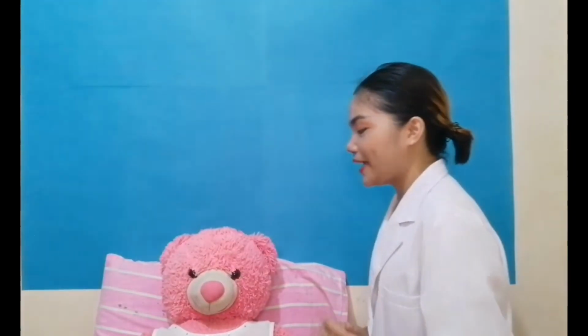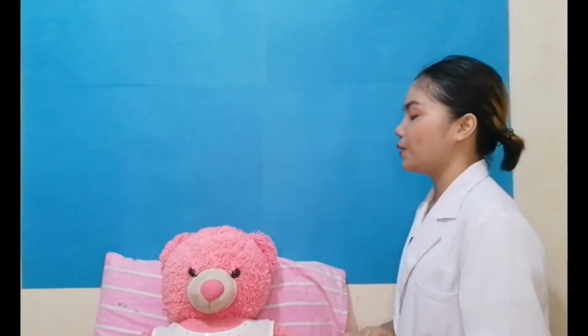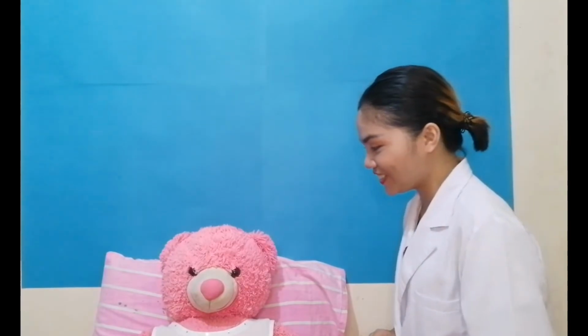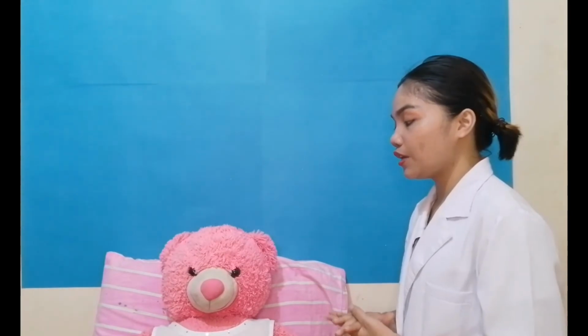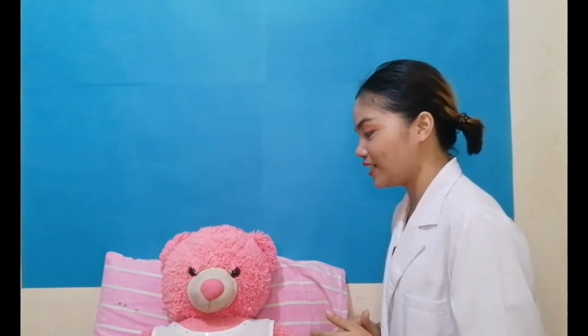Hi sir, good morning. My name is Kabilin, a student nurse from the University of Mindanao. May I know your name, sir? Can I check your ID band po? Okay, Mr. Ramos. Today I am going to perform a urinary catheterization in which I will insert a catheter through your penis and urethra into the bladder for instillation or removal of fluids. Is that okay, sir? Thank you, sir.